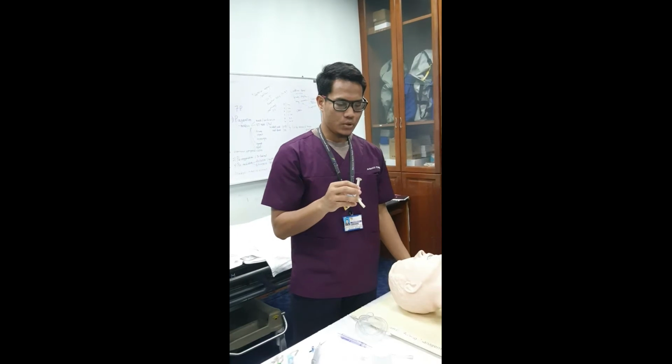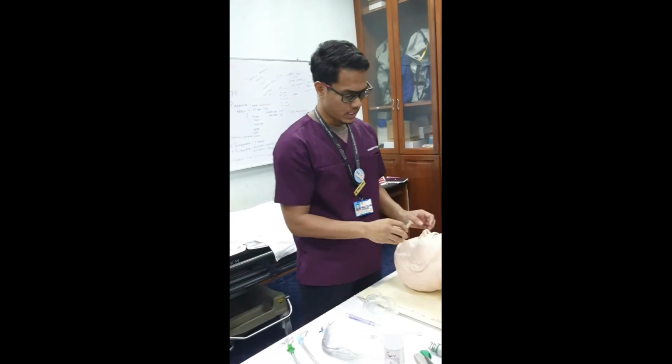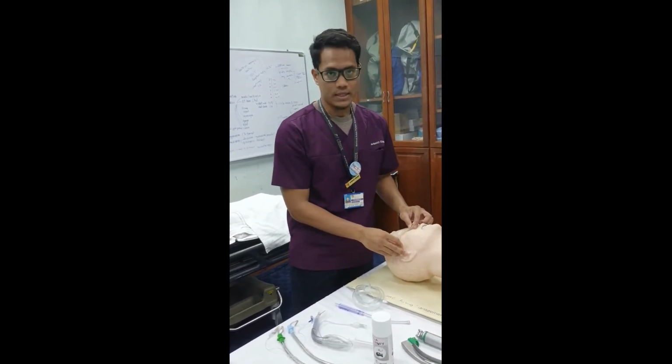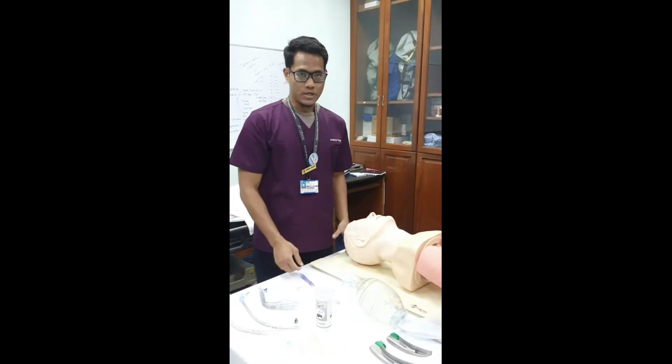It is the same. We use it in an unconscious patient to prevent airway obstruction. How do we choose the size? We measure from the nostril to the tragus of the ear. Next, I will show you how we do intubation.